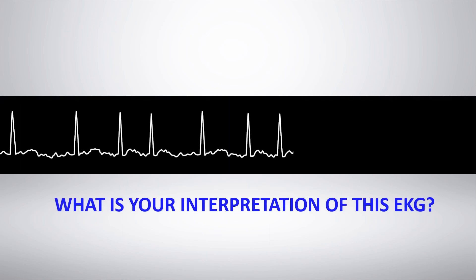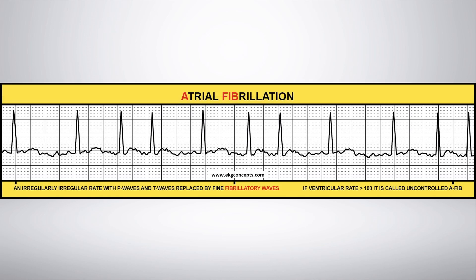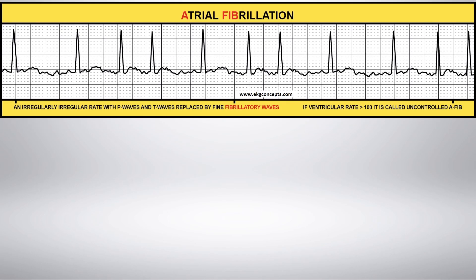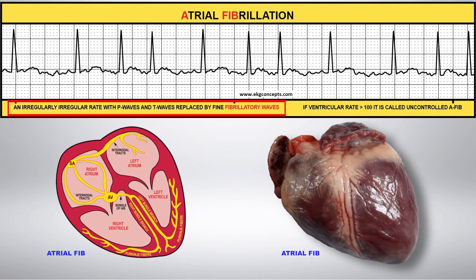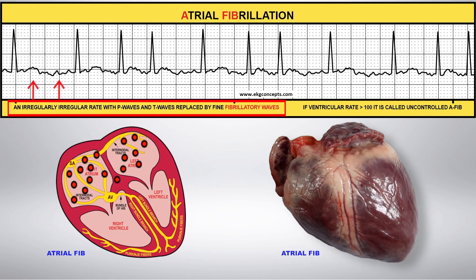What is your interpretation of this EKG rhythm strip? Atrial Fibrillation. Atrial Fib is multiple impulses originating in the atrium in places other than the SA node, at a rate of up to 400 to 600 beats per minute.